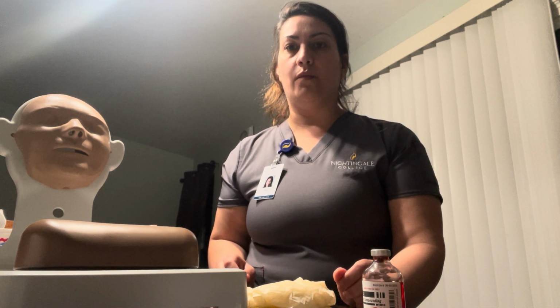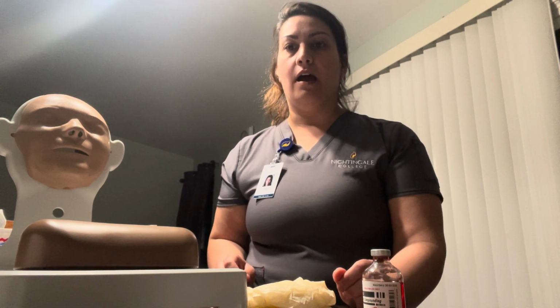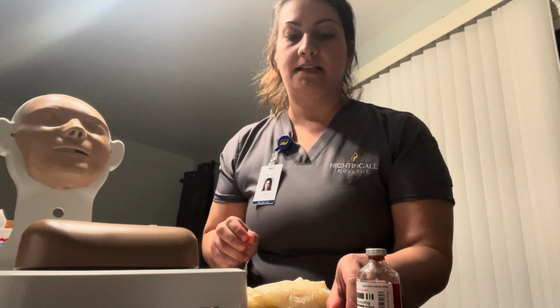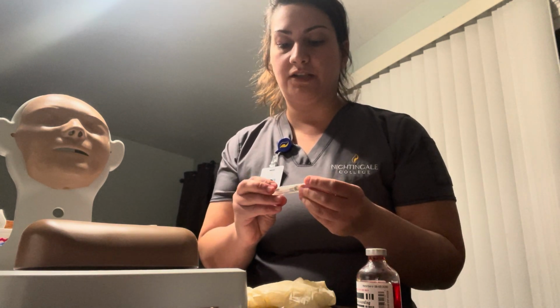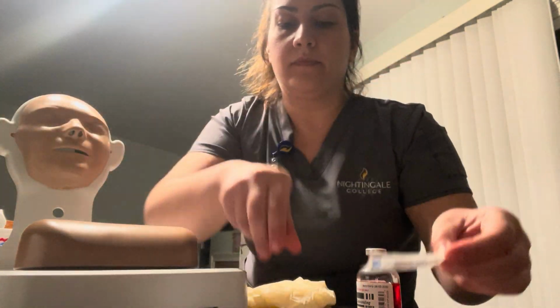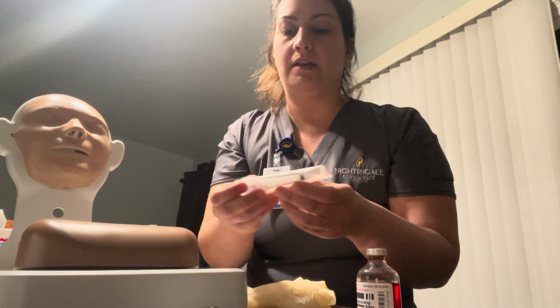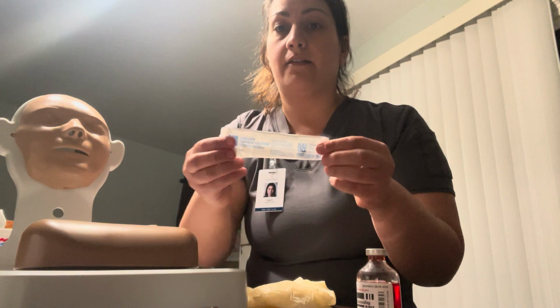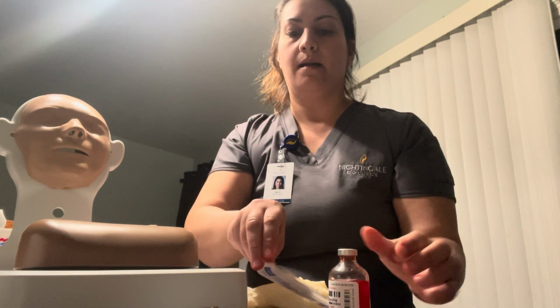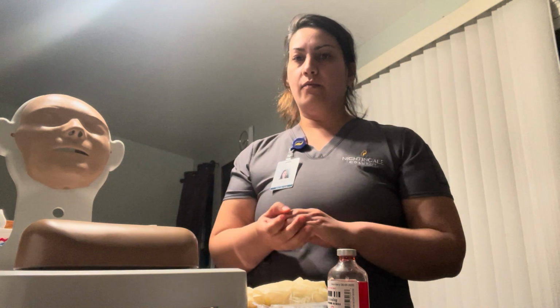to 1.5 needle, a 1 milliliter syringe. In this case, we're going to use the 22 gauge needle, and we are going to use the 3 milliliter syringe. Okay, perfect. Now we got that out of the way.